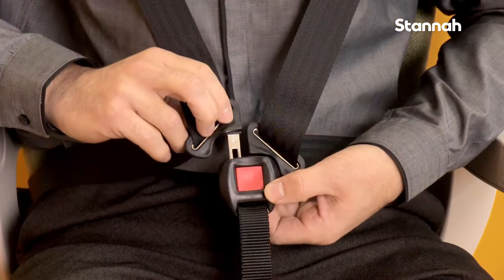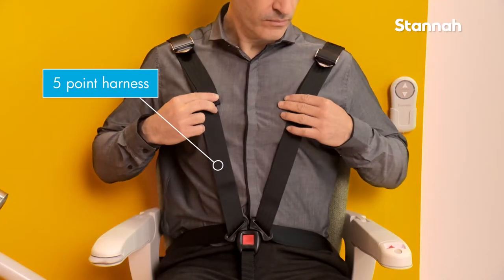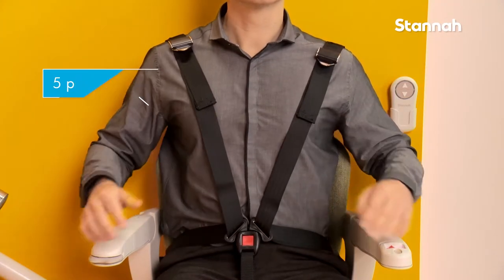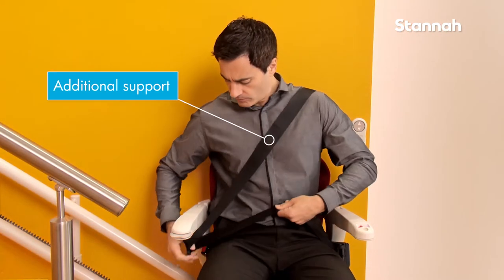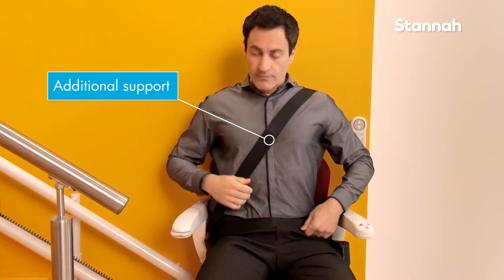A 5-point seatbelt which has been designed for users with limited control of their upper body. And finally, a diagonal side fastening seatbelt giving the user additional support across their upper body.